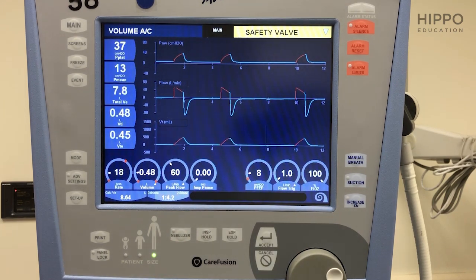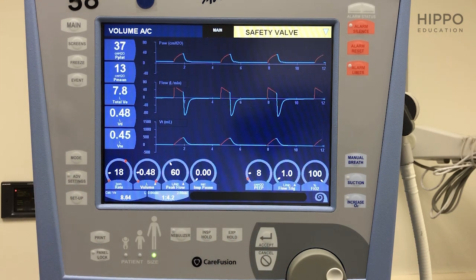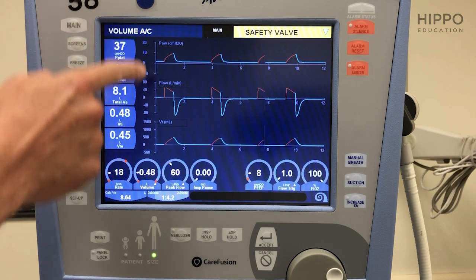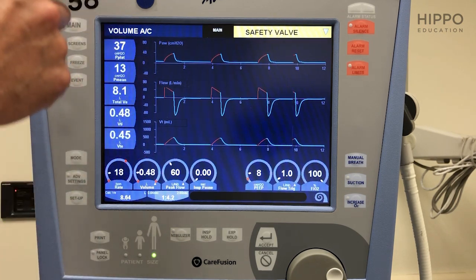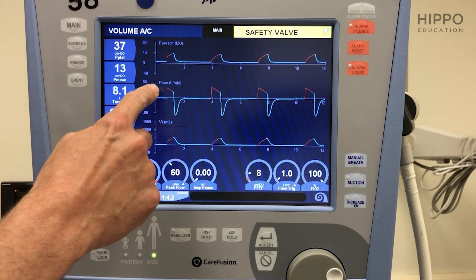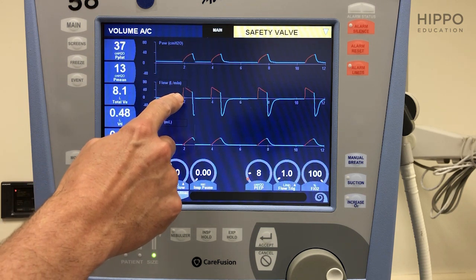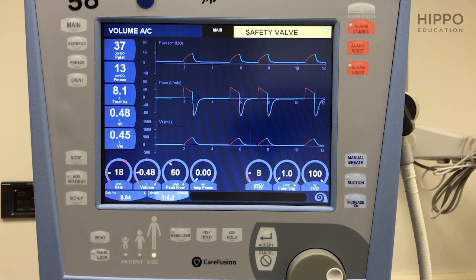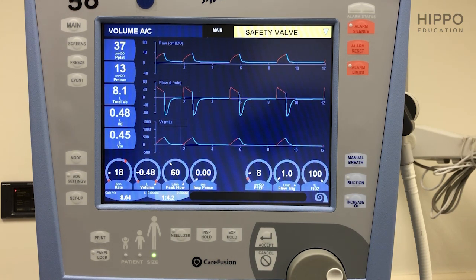And that's it — those are the four big parameters, all here on the bottom. Just go to them, tap them, make your changes, and accept. Now let's look at some of the other features. Here on your screen, you'll see your waveform — it gives you three different types, but basically it's an inspiratory phase followed by expiration. The red is inspiration and the down is expiration, and you can see it's delivering regular breaths to this patient.